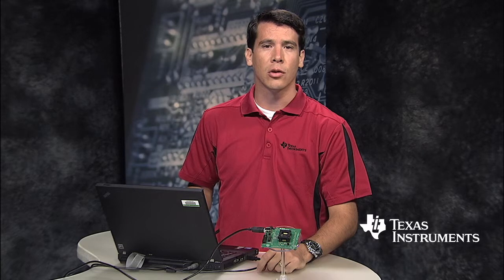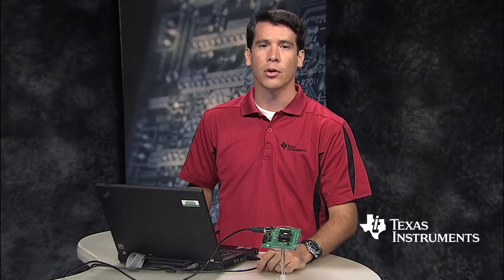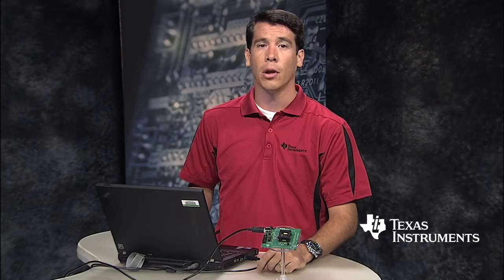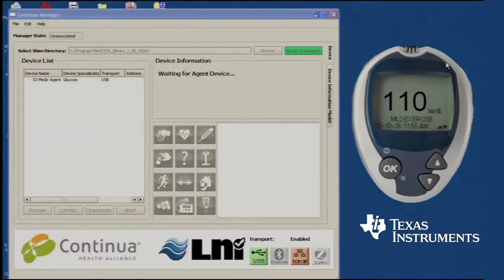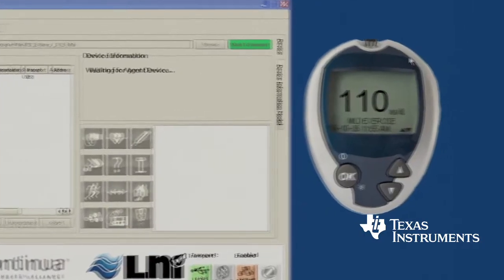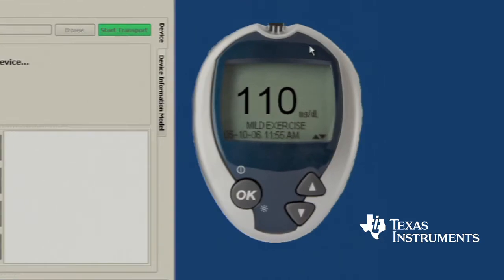To demonstrate our solution, I will configure the target board to emulate a blood glucose meter by opening this application on my laptop. I can change the reading if I like, and then send the data to the host.